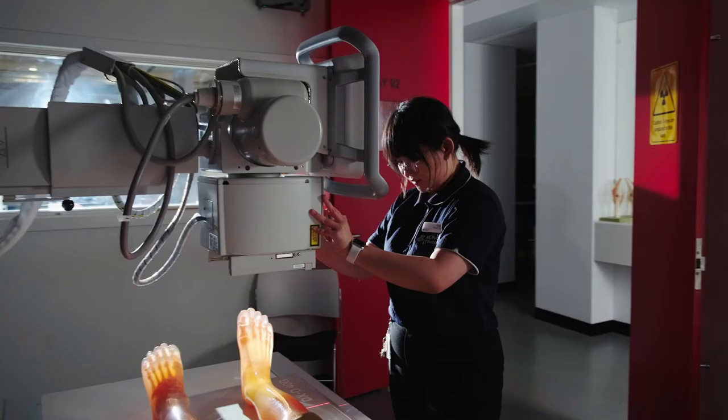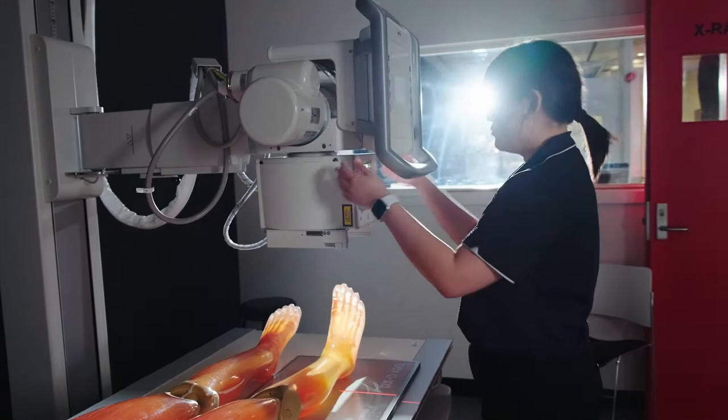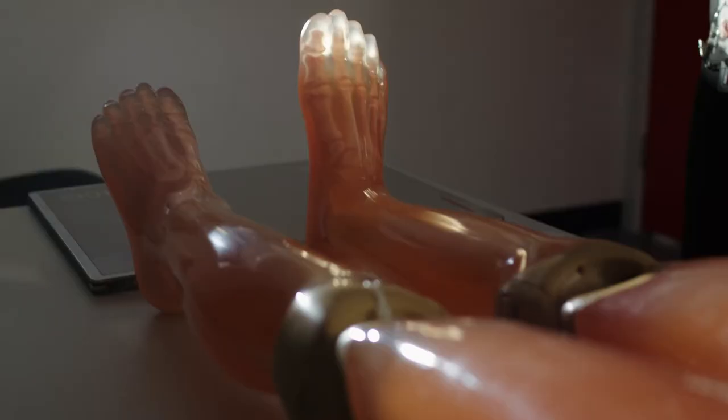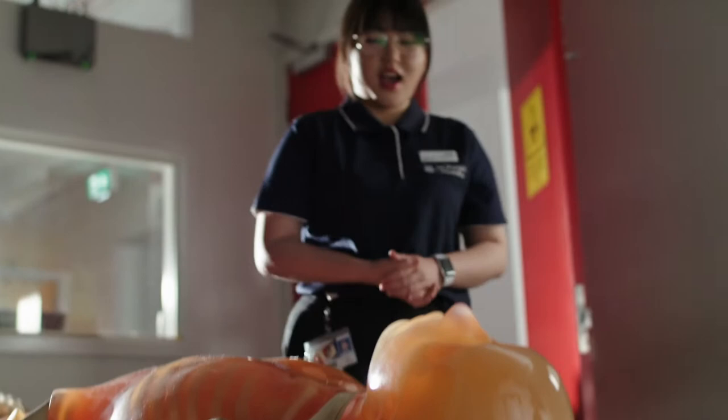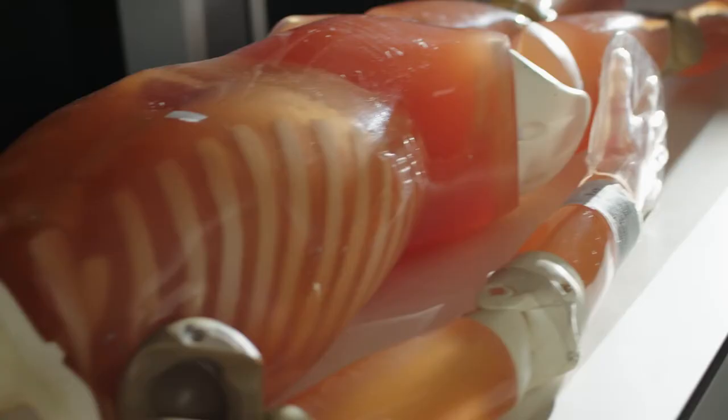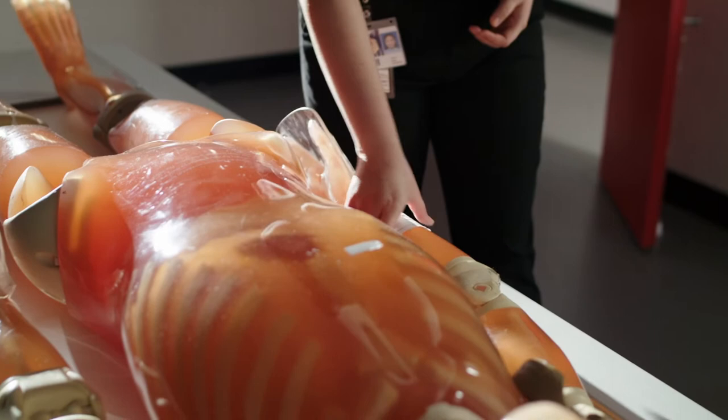Radiography plays an integral part in most patients' healthcare journeys. Today we're going to introduce you to the basics of imaging a limb here in our radiography skills lab at the university. Today we have a patient for an ankle x-ray, and Susan is just introducing herself to the patient now, explaining the procedure, checking the patient's details to ensure we have the correct person.